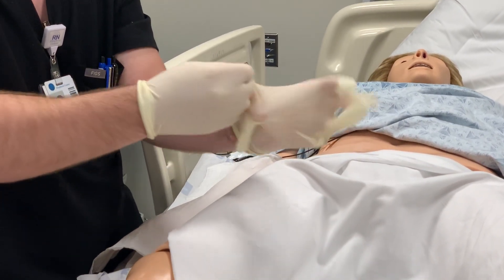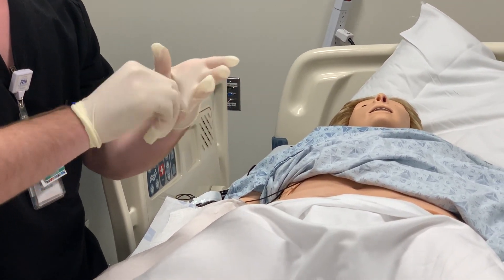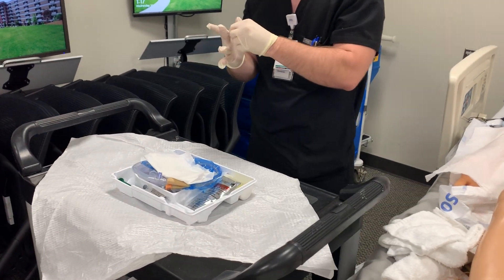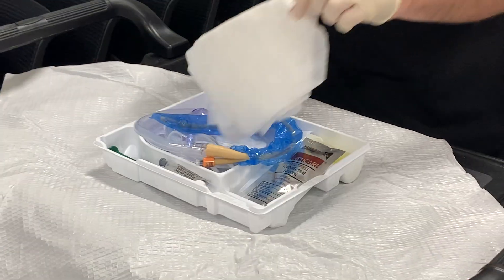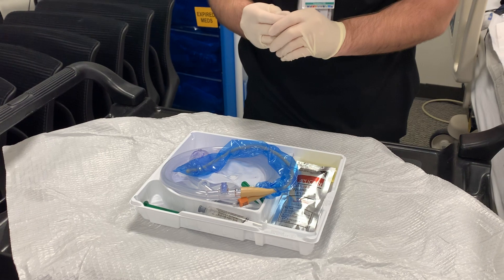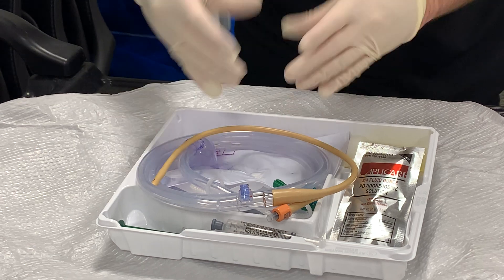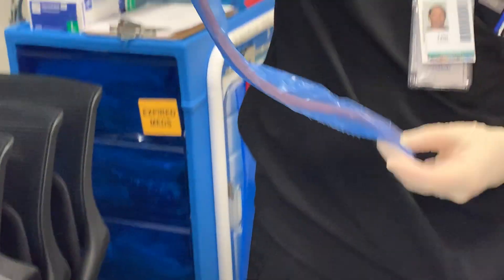Putting on these gloves can be a little difficult — just give yourself time. You may have an additional drape piece included; we don't typically use that for suprapubic tube changes, so you can discard it or use it to prevent mess. Next, we will remove the blue outer wrapping from the catheter, being careful not to let the catheter drop outside of the sterile field. If you are adding a catheter to the system, remove that blue packaging and then attach the catheter to the bedside bag that is inside the system.